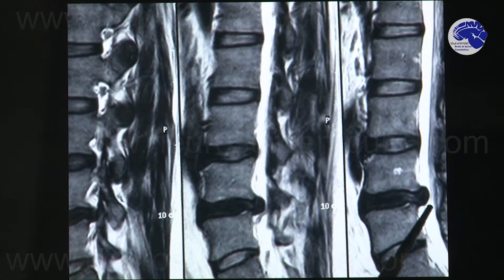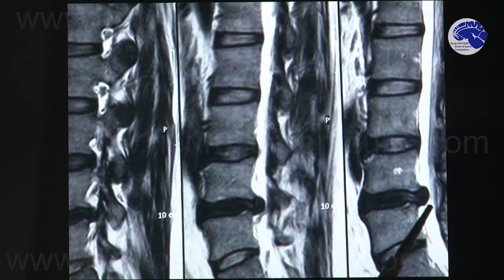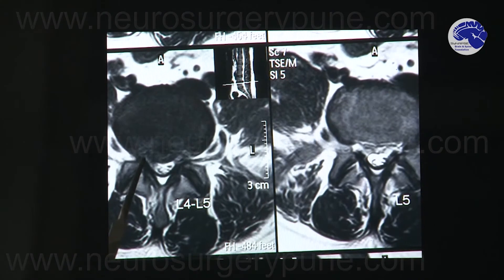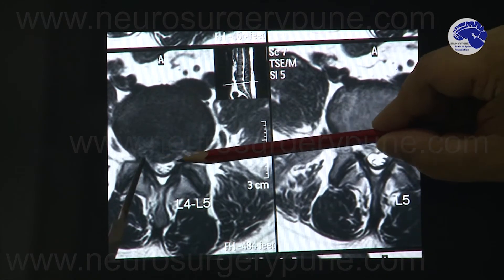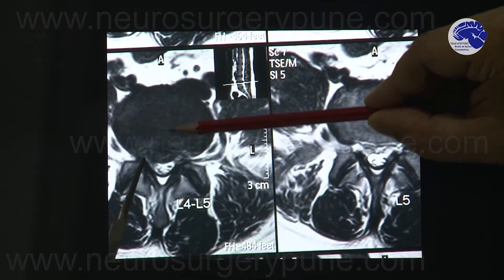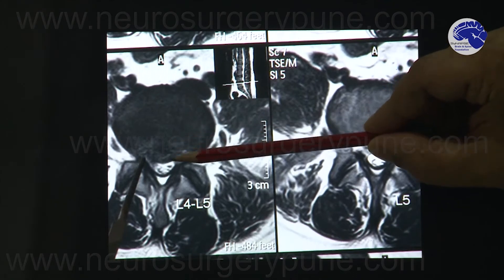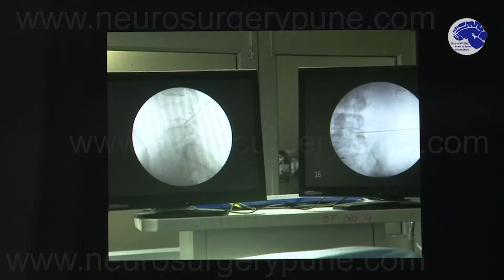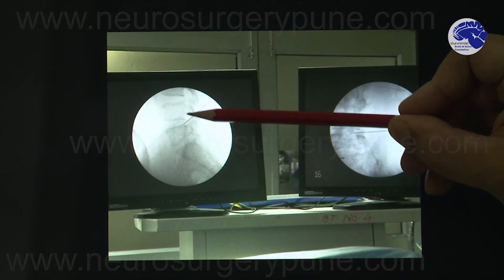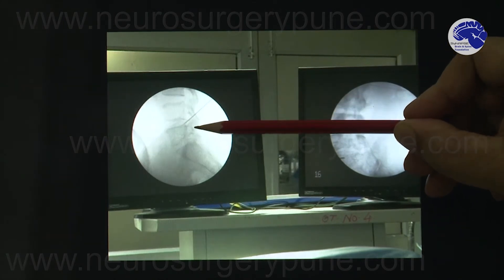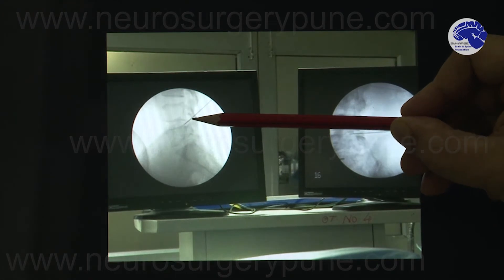In endoscopic discectomy we have to remember that it can be done under local anesthesia or general anesthesia. In his case he chose local anesthesia, so we numbed the portion we were going to incise. This other MRI view shows the disc prolapse — you can see the convex portion of disc that has prolapsed inside. A small needle was then passed under X-ray or fluoroscopic guidance into his L4-L5 disc space at the desired level.